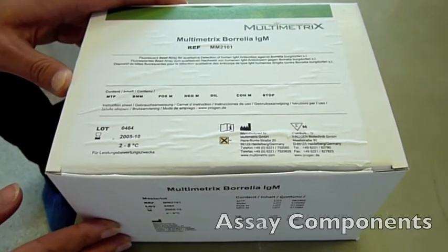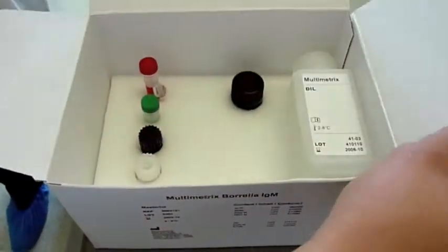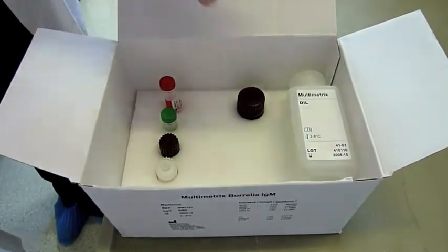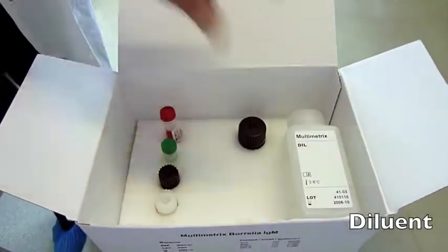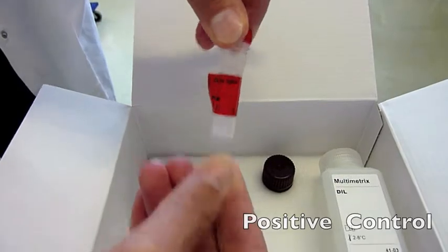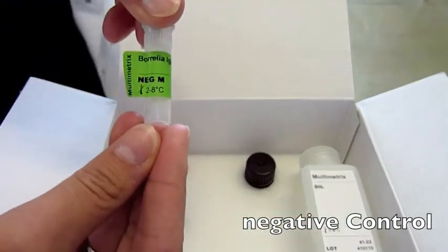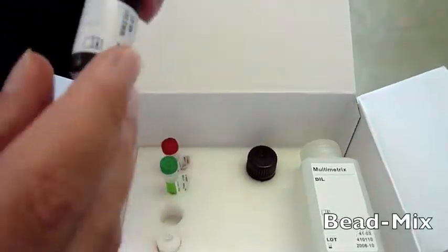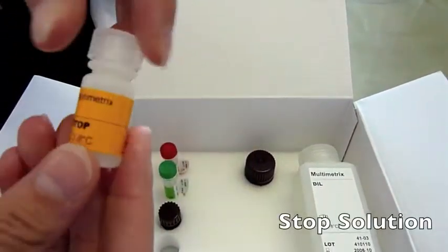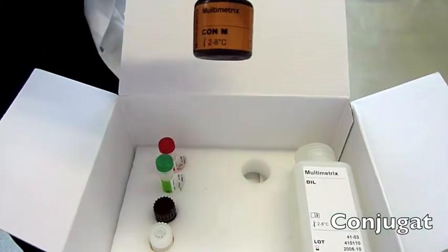This example shows the Borrelia IgM assay from Multimetrics. The kit consists of dilution solution, positive control, negative control, the bead mix, stop solution, and conjugate.